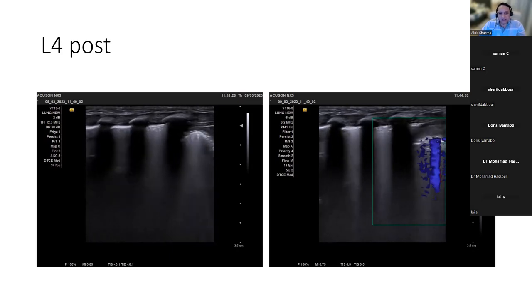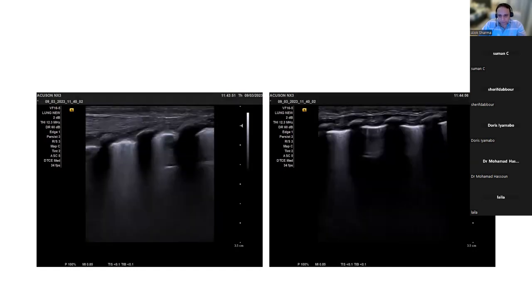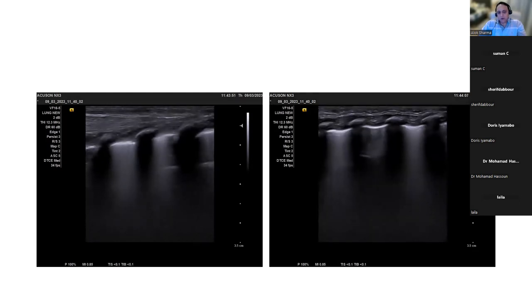Can I just go back to your last slide? Just one comment. If you click on the images, you've got a B profile, compact B lines, and then that A profile on the right side at the top, but we're missing the deeper side just because we need to reduce the frequency to get better depth. The advantage of increasing your edge enhancement is you'll get much better visible A lines right to the bottom. So increase your edge enhancement to maybe 2-3, not more than that.